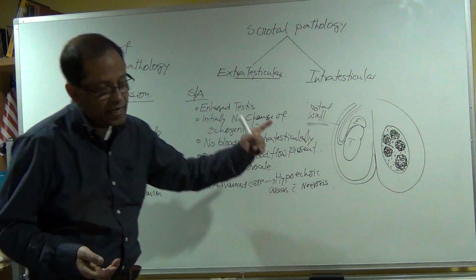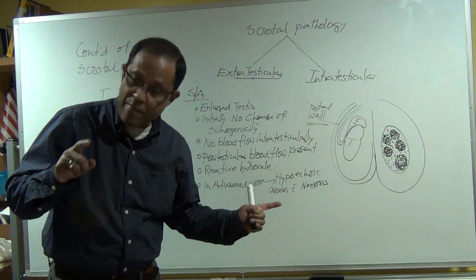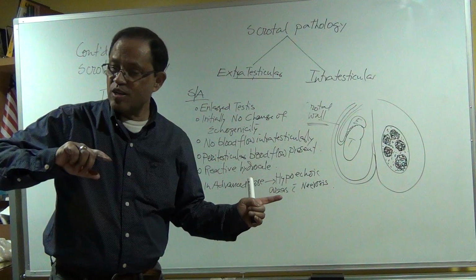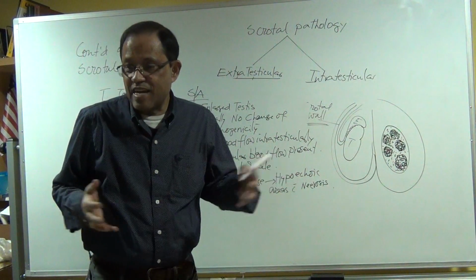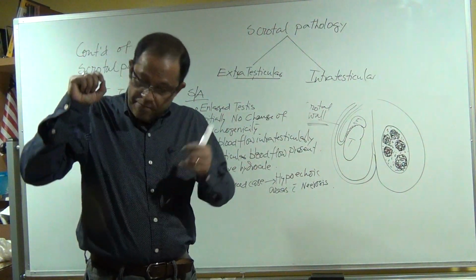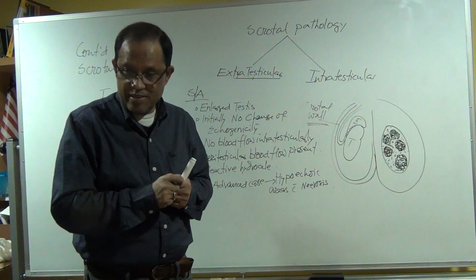So now you click the color, right? Do I need to increase the color? No. If you increase the color, there might be color, but don't increase it in such a way that there is artifact and then we feel like, oh, it is alive, there is color. No, don't do that. And if color is not coming with the color Doppler, then use power Doppler.